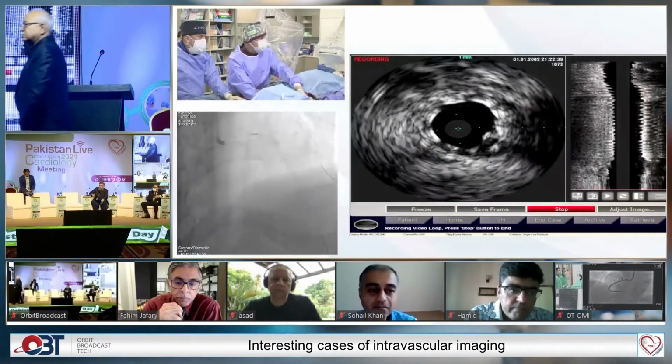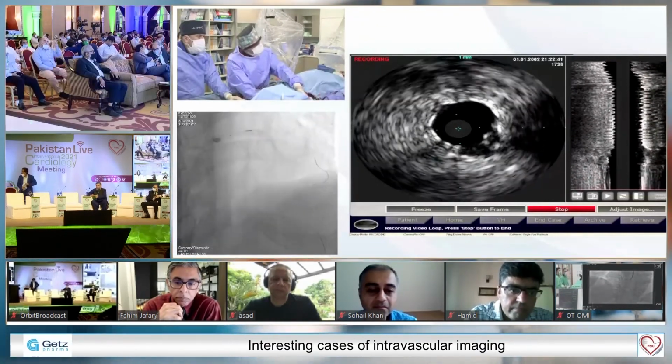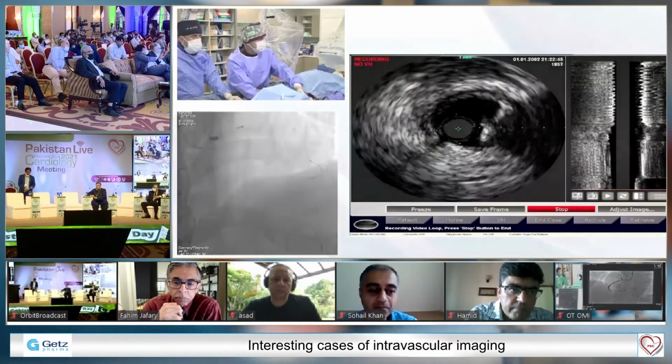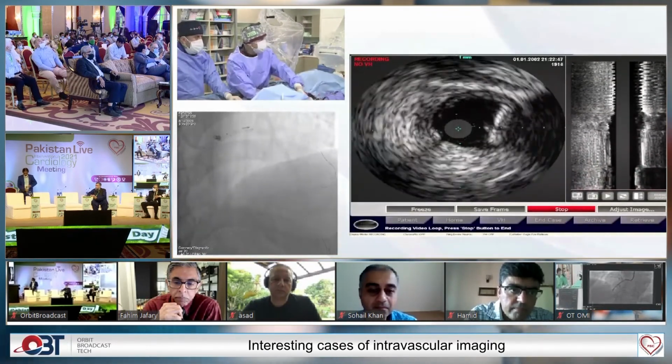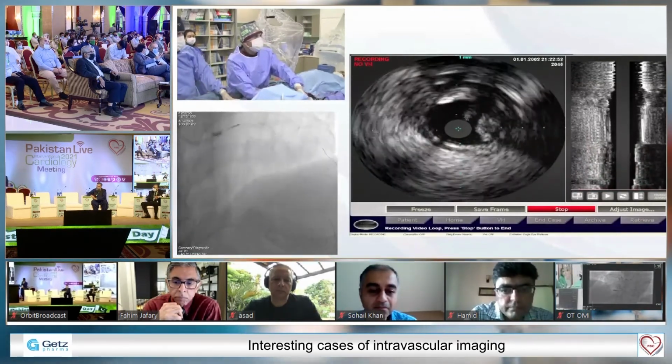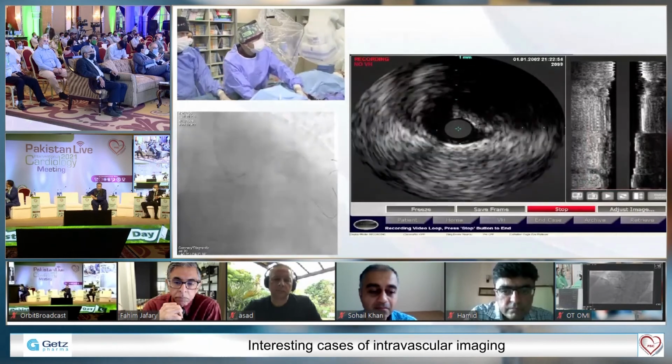And here we can go easily for all, right? So proximal, we do short for balloon. I have some plaque. It's 3 o'clock, but it's fine. I don't want to put another stent here. What do you think? Let's see the ostium.